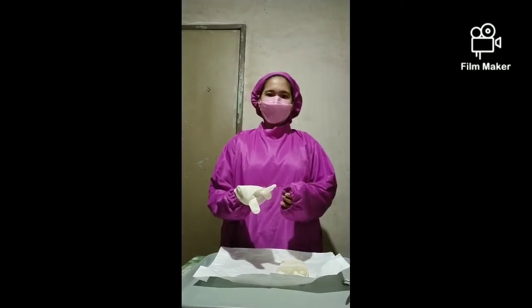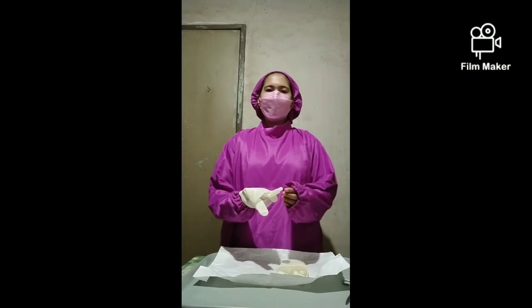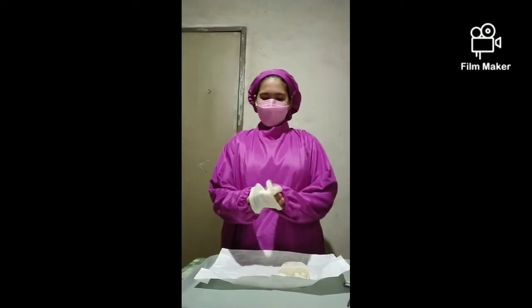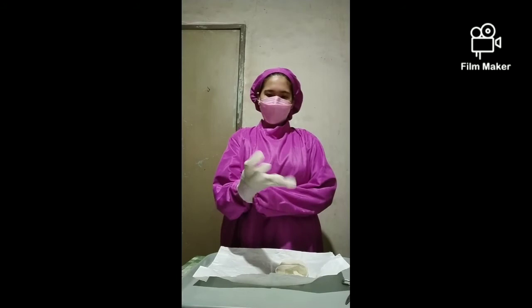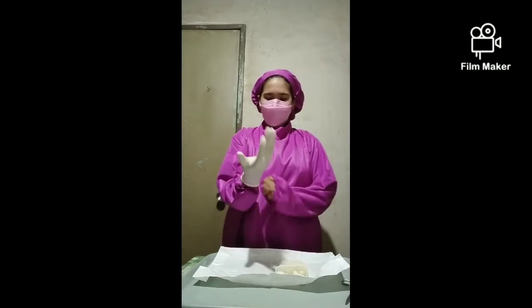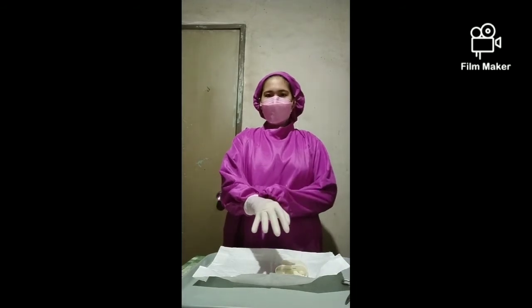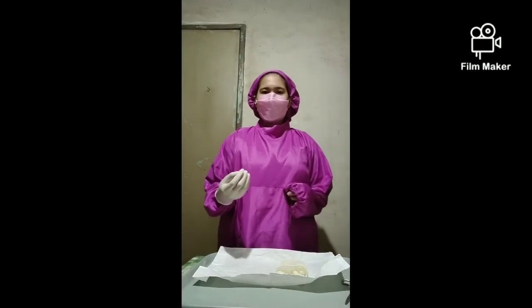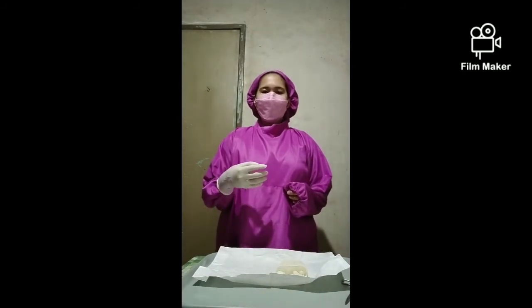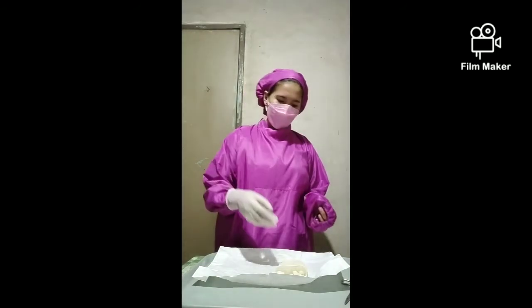Then use the left hand inside down to pull the right glove cuff over the right gown cuff. Adjust the right glove over the right gown cuff. Work the right hand into the glove, using the gloved right hand. Then pick up the left glove.